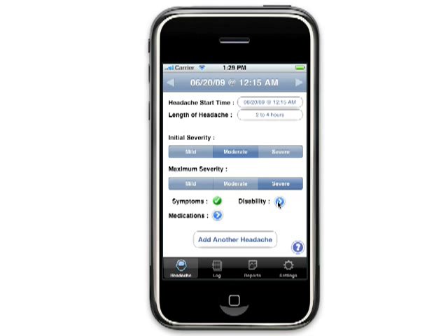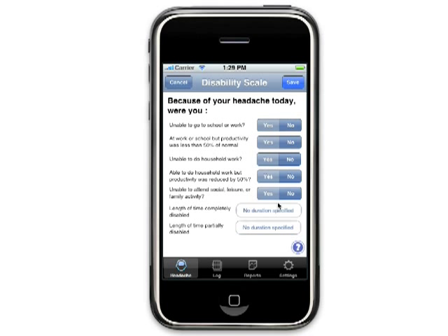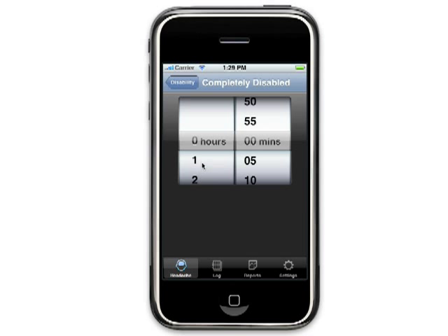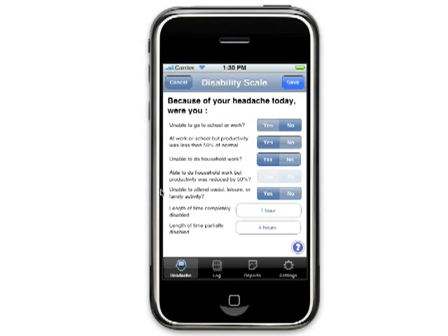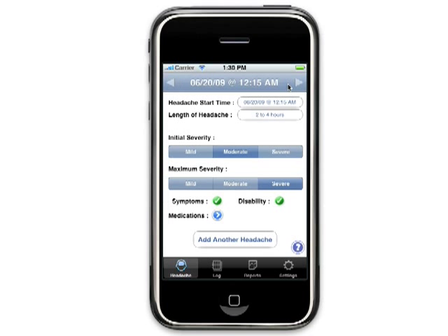Next, let's enter disability information. Press the arrow on the headache entry screen to open the disability screen. Eye Headache uses the MIDAS scale — MIDAS stands for Migraine Disability Assessment Scale. It is widely used in research studies to determine the effectiveness of treatments and their impact on the patient's disability. Answer either yes or no to the questions. Note: if you answer yes to question 1, question 2 is disabled; if you answer yes to question 3, question 4 is disabled. Estimate the amount of time you were completely disabled because of the headache and the amount of time you were partially disabled. Don't include any time you were partially disabled in the time you were completely disabled. Return to the disability screen as your headache progresses to update information. Press save when done or cancel to return to the headache entry screen without saving.